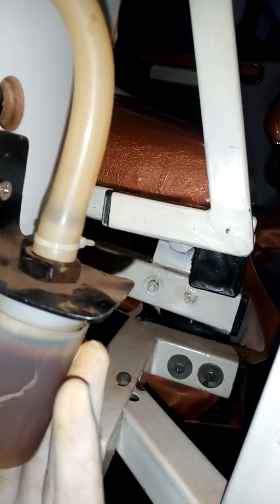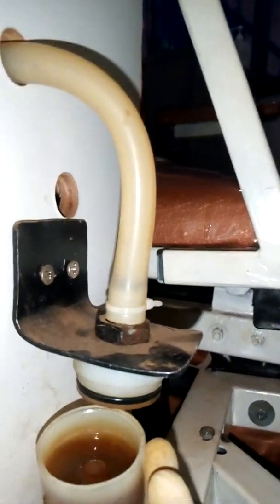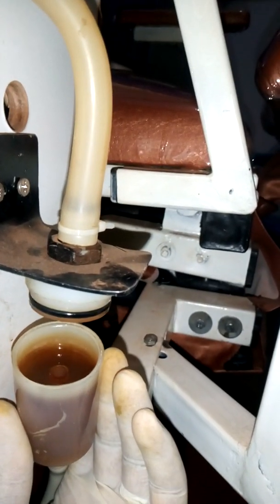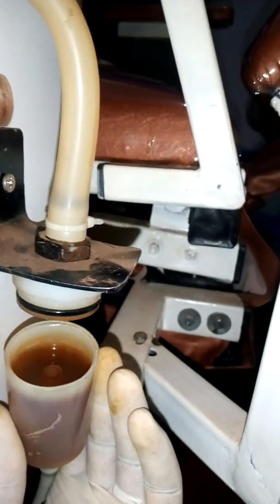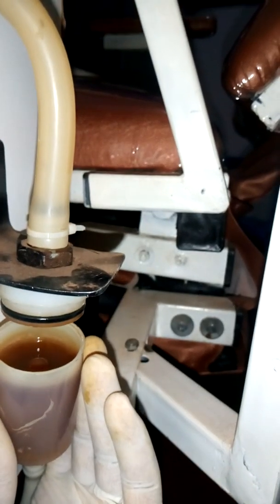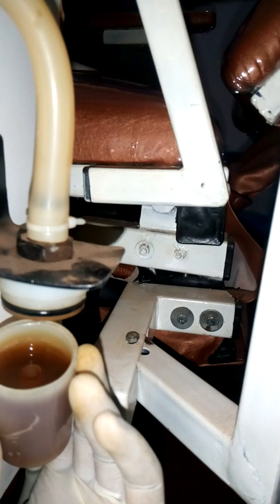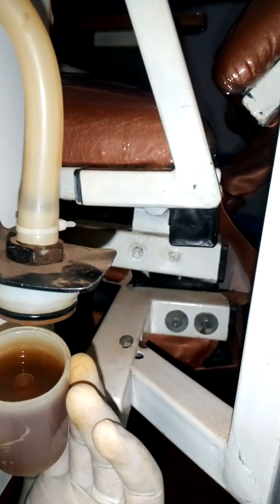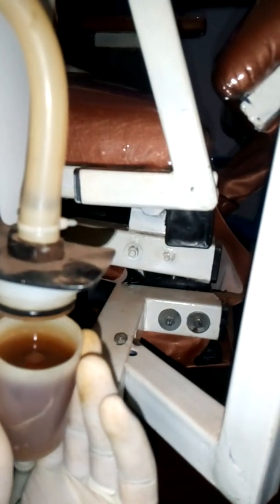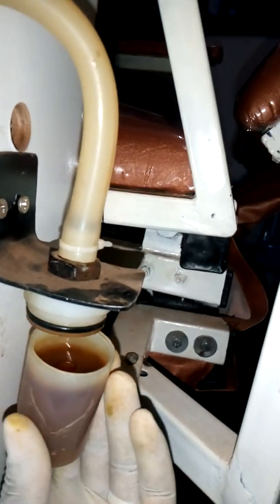This section also has a cup. Whenever suction brings in any debris, you would not want that debris to go inside and block the venturi. So the heavy debris will drop down into the cup, and when you're cleaning up you can always remove every debris from the cup.